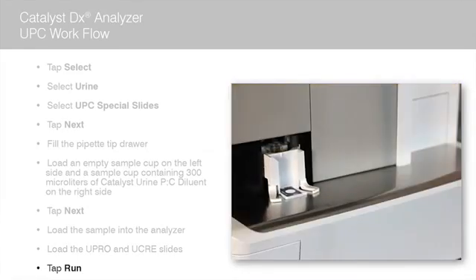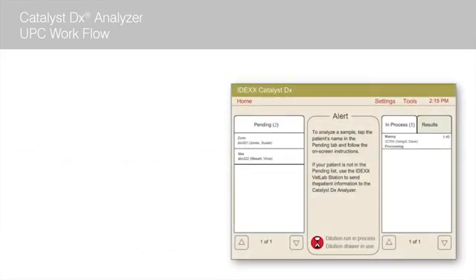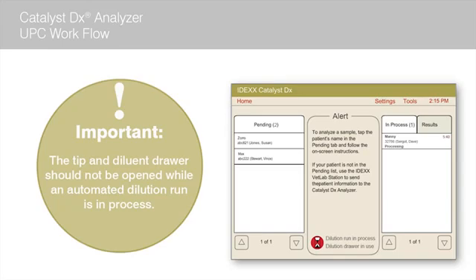The Catalyst DX Analyzer begins to process the patient sample automatically. A timer displays next to the patient's name in the In Process list indicating the time remaining until the run is complete. The tip and diluent drawer should not be opened while an automated dilution run is in process. You can verify if an automated dilution run is in process by reviewing the status icons on the Catalyst DX home screen.